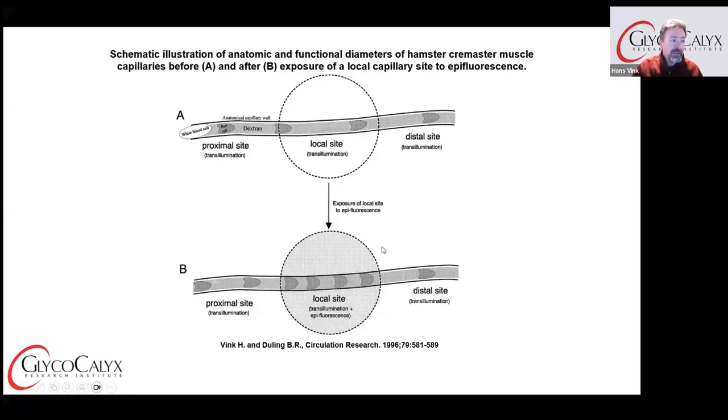And then when they leave the area that was exposed to the bright light, suddenly they would speed up again, and the distances between the red cells would increase. So definitely we didn't change anything in the blood content flowing through the capillary, but something that we did in this dotted area caused the red cell content, or the tube hematocrit, to double or triple, even within a minute.